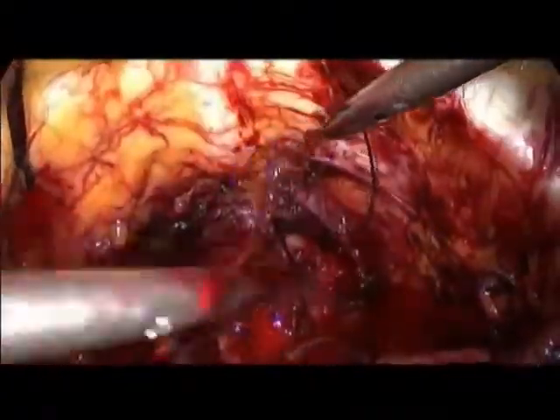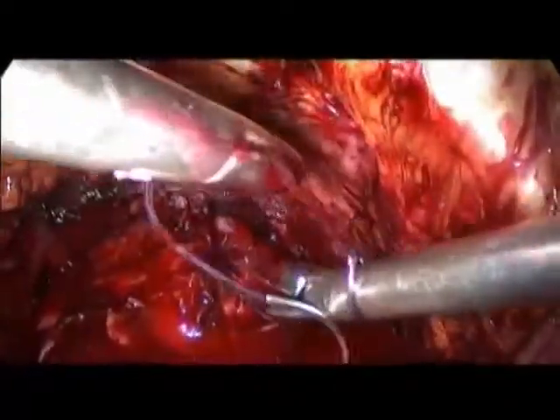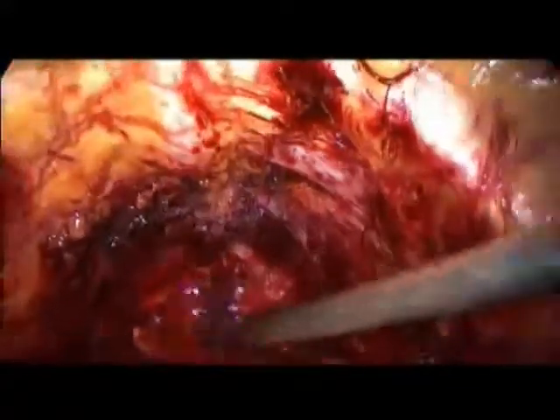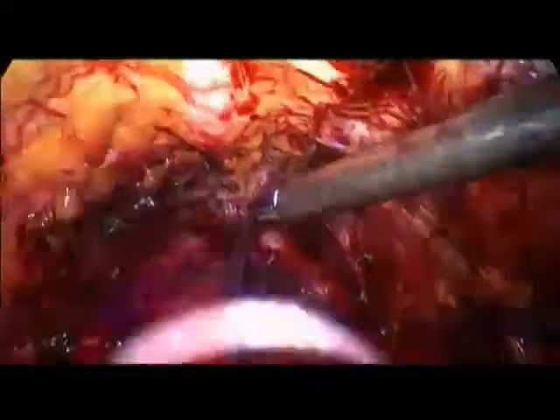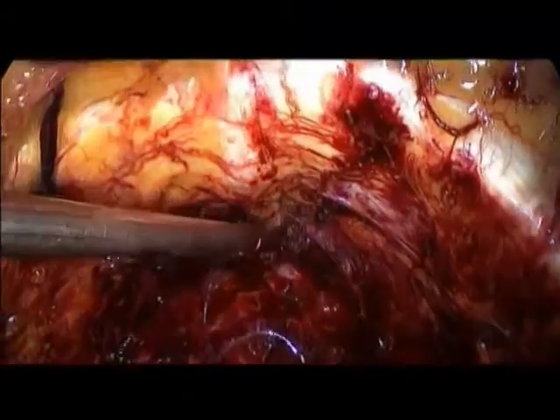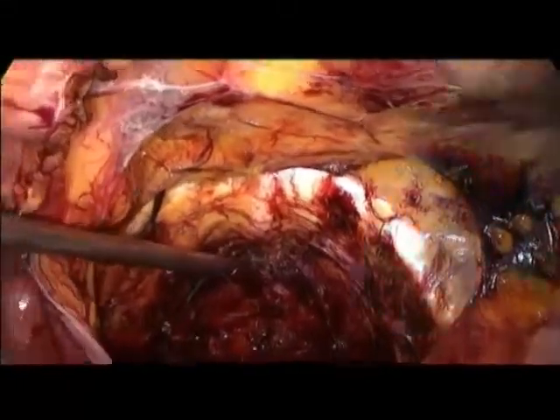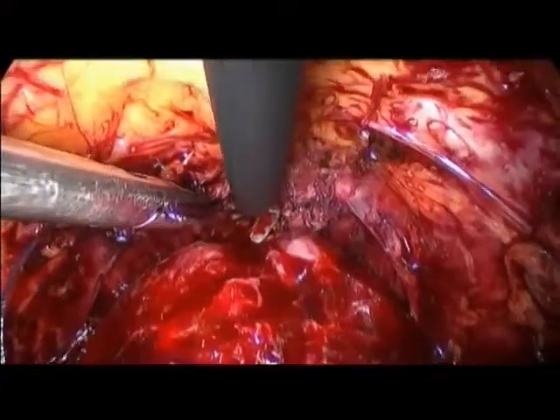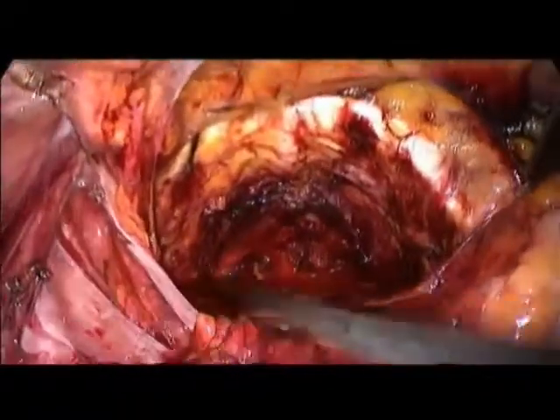And you see that there is few questions to ask yourself about the level of that stitch because it is completely defined by the placement of the forceps. Scissors. No, this one. Any question about all this? Okay.